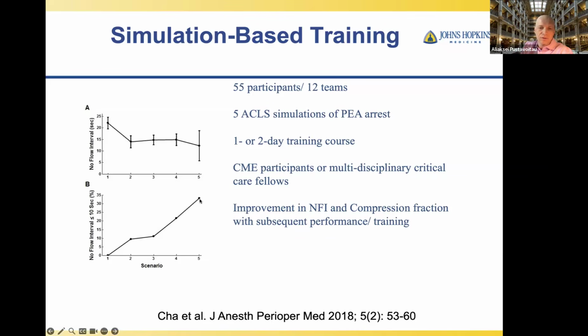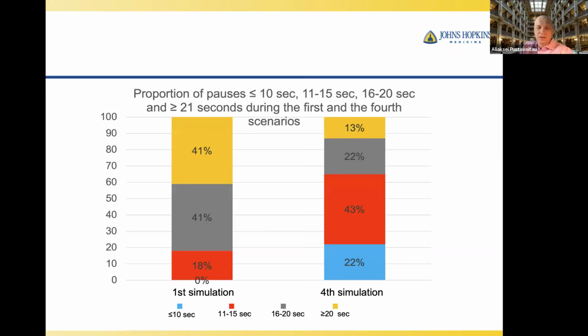And even after 5 of those scenarios, we're still only roughly 35% compliant. But the average interval shortens to like 12 seconds or so. Not perfect, but it does take multiple repetitions for people to perform well and really be aware of how to manage those pauses.